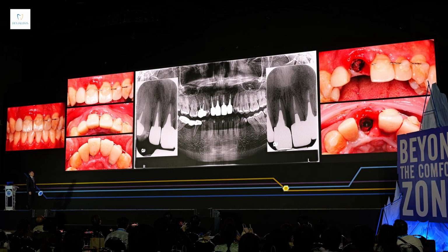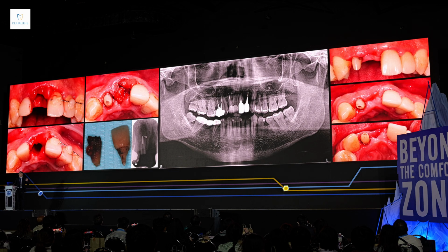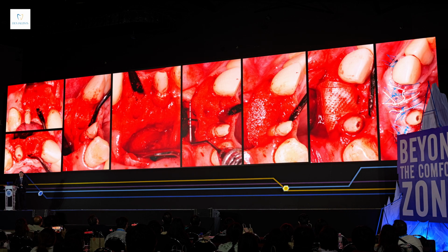The patient came to my office with fractured front teeth, and because of multiple trauma, the previous dentist splinted them together, and there was severe infection as well. So I was not able to treat it at the time the patient came in, so I extracted later on, and I didn't do anything else. I just extracted, and then it healed up. I let the tissue heal up so that I have enough soft tissue for bone augmentation. That's my purpose for it, okay? Then when I open up, if you see, this is a huge defect, right?